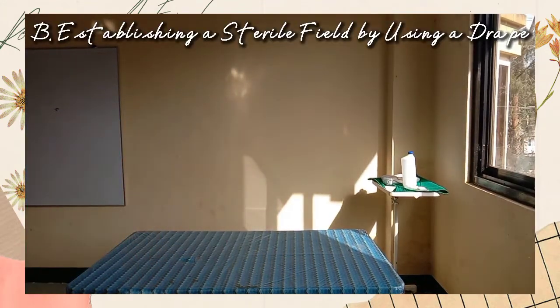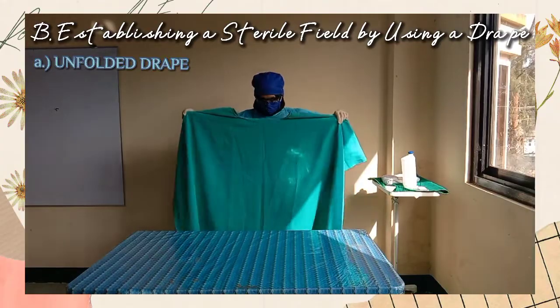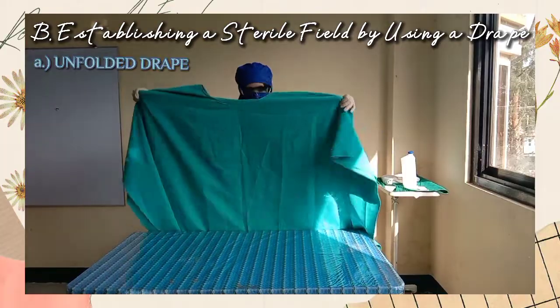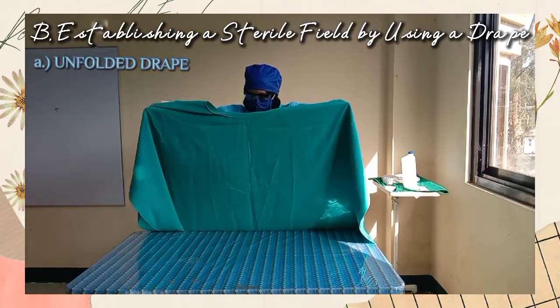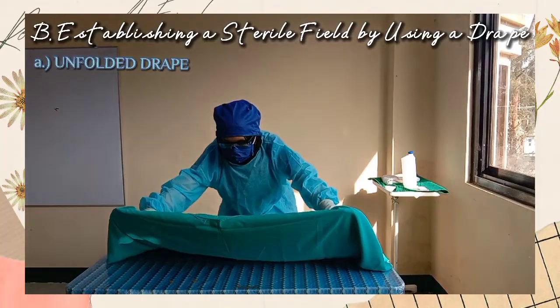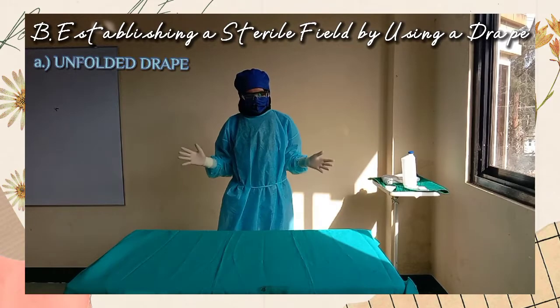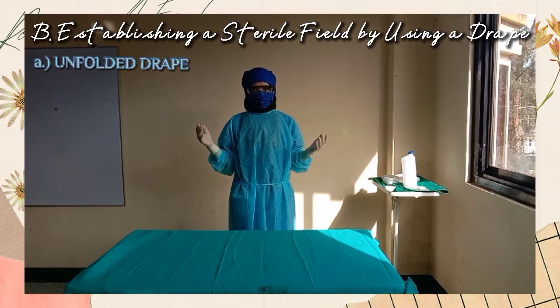The scrub person drapes an unsterile table by placing the drape over the unsterile surface nearest self first and carefully completing the coverage of the far side. Gloved hands are protected by cuffing a drape over them to facilitate easy placing of the drape, and this could also prevent the gown from being in contact with the unsterile table when the far side will be the one to cover first.